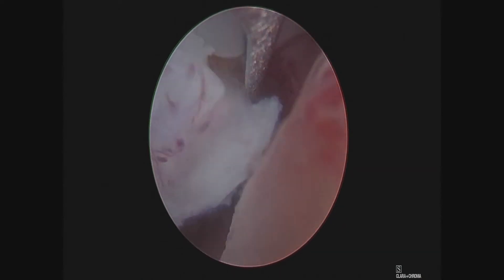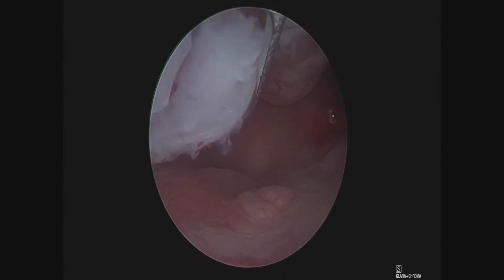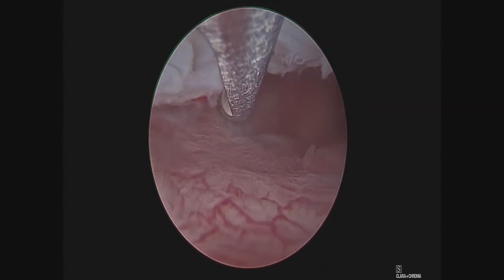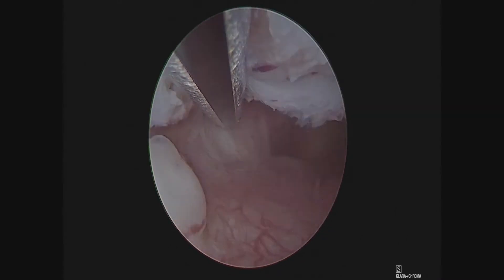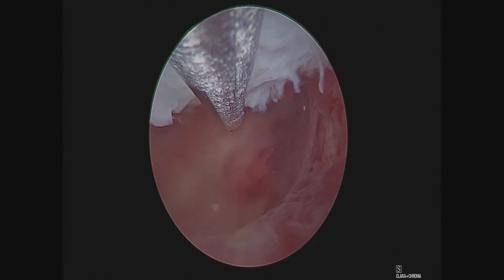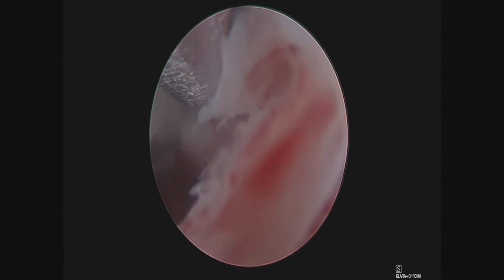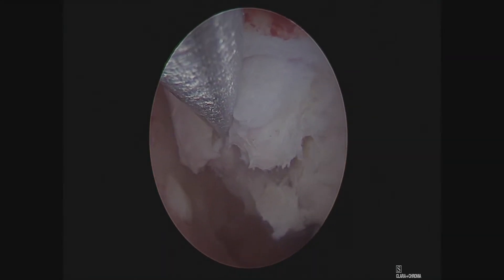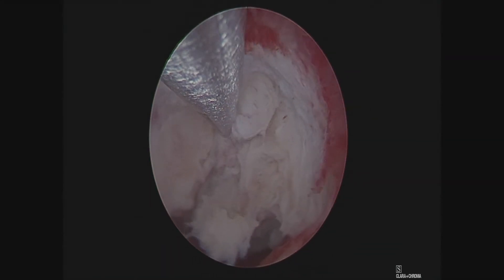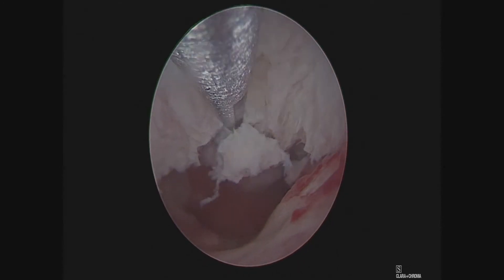We were able to take this out without making any incisions, by putting a speculum inside the vagina and then a camera into the uterus. This instrument called a Myosure has a window that rapidly dissects the fibroid. With the hysteroscope, or the camera, as you can see, I can see exactly what I'm doing. This fibroid was causing terrific pain and bleeding for this woman. By taking this out without any incisions, you can see that she will feel much better.